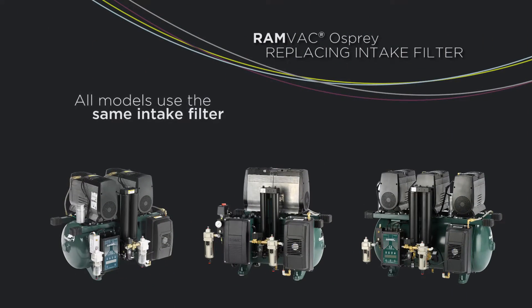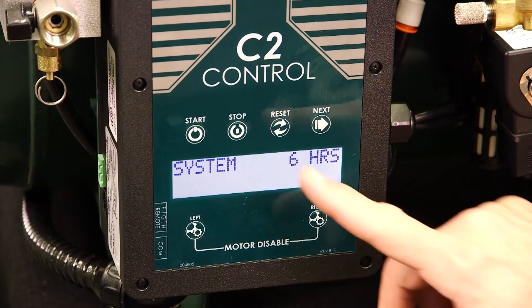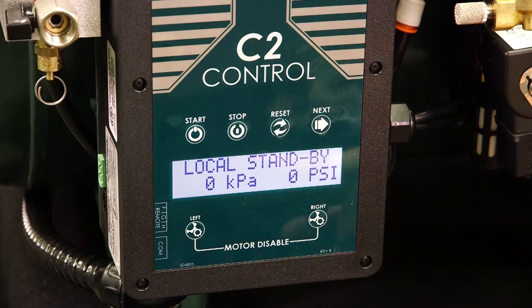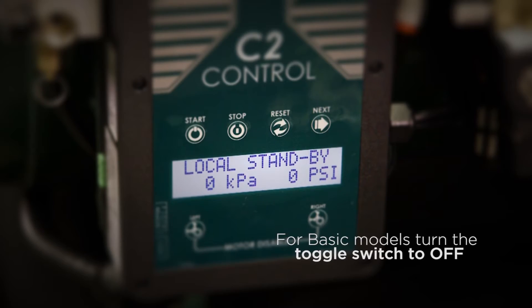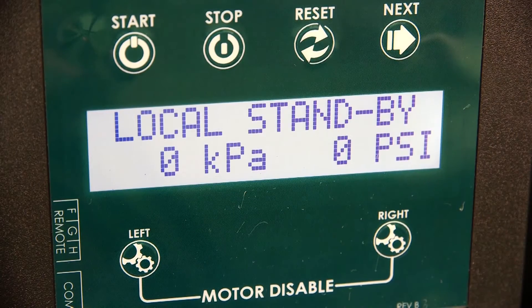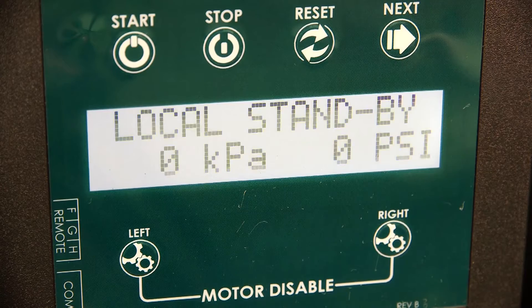Please note, all models use the same intake filter. To replace the intake filter, start by turning the compressor off. For smart models, use the stop button on the C2 control. For basic models, use the toggle switch to power down. The second step is to unplug the compressor to remove power.